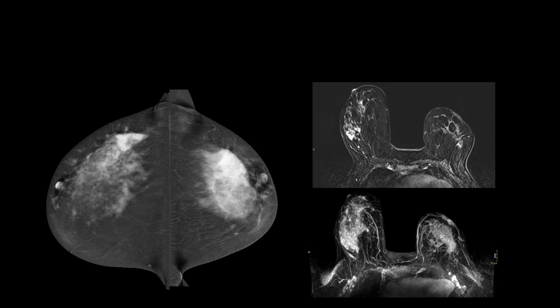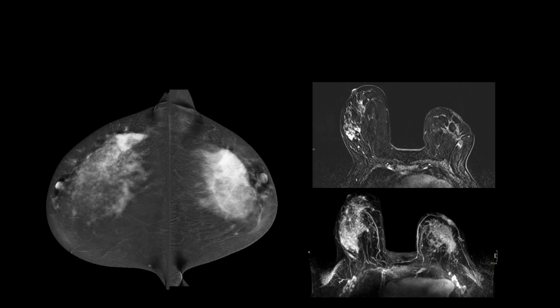And this example is just to show you how contrast-enhanced mammography is equivalent to MRI by showing the extent of the disease. The only thing that we may not appreciate would be the lymph nodes. But we're going to do ultrasound anyway, so it doesn't matter, right? So there you have one appointment, we can solve everything, and this is what happened with this patient.